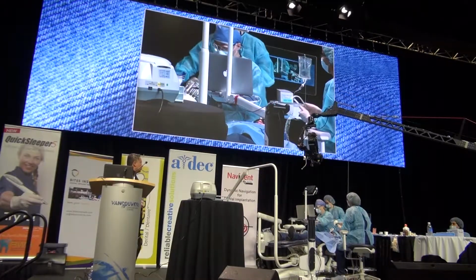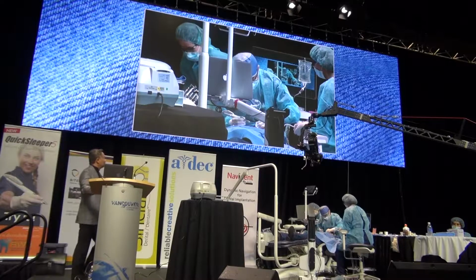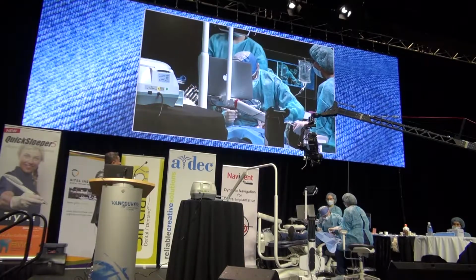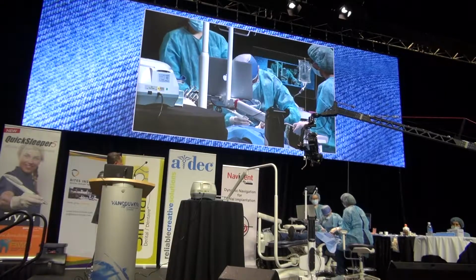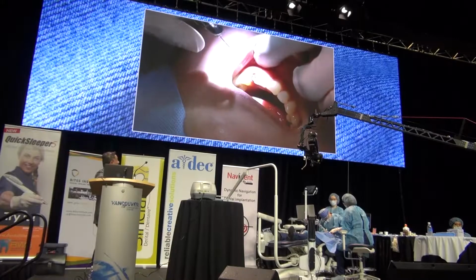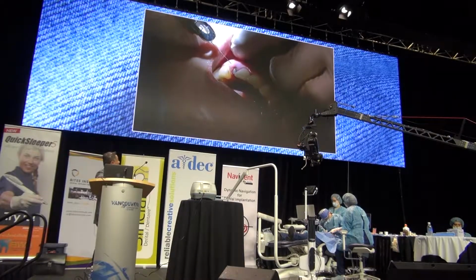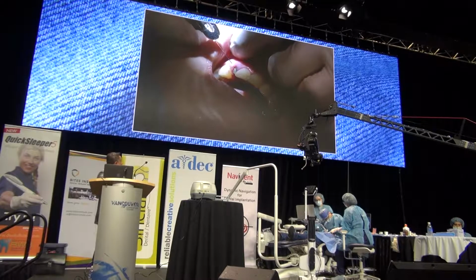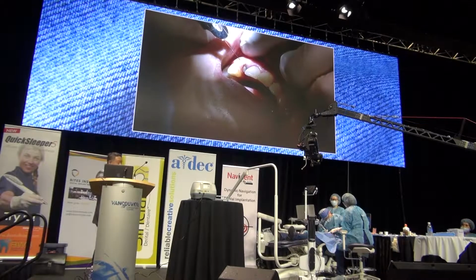So what Dr. Kwan is going to do is first anesthetize the soft tissues. There's a double bevel needle that's designed with a quick sleeper. It's proprietary to this needle. It's not the normal ones. So let me say this. I've done this to patients that freak out coming to the dentist. I've done this to dentists and hygienists. And for some reason, with this double bevel design, it does not hurt the patients. You just got to try it on yourself or on a patient.